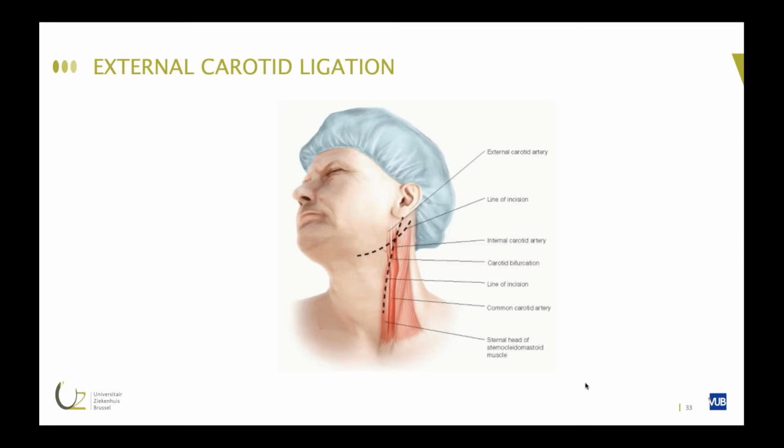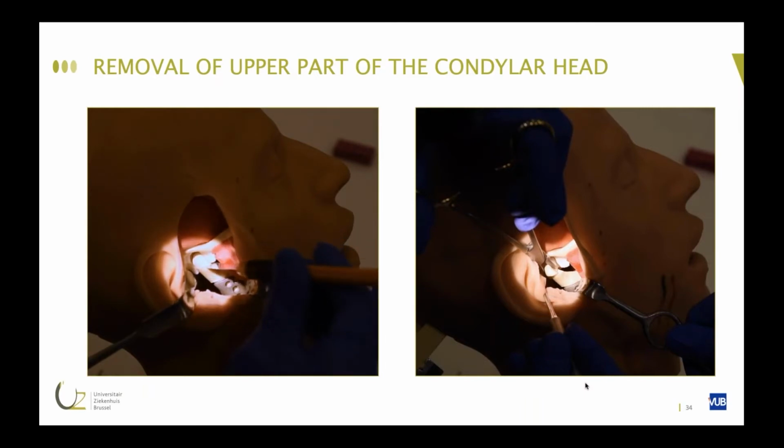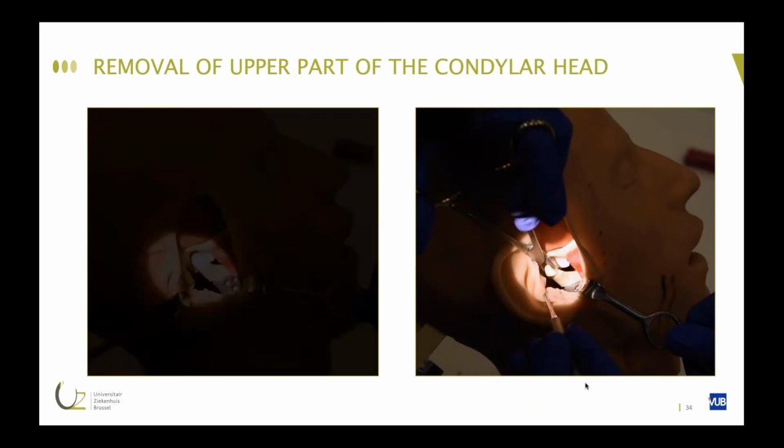It's very important. When you check the literature, it only happens in 1 out of 1,000 cases that such a bleeding cannot be stopped. This is life-threatening, colleagues. Okay, I use here a manual saw, but that's for the model surgery. In the hospital, I use, of course, a reciprocating saw.